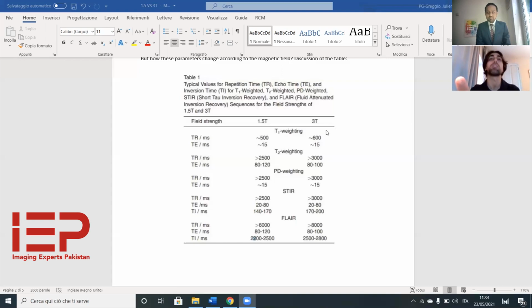However, I would probably recommend remaining at 700 here as well, because there is always the possibility to split with the concatenations. So we can split different TRs in the same measurement, which allows us to preserve the weighting of the sequences.